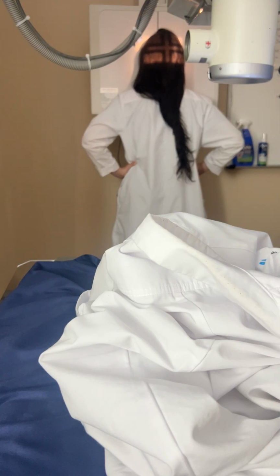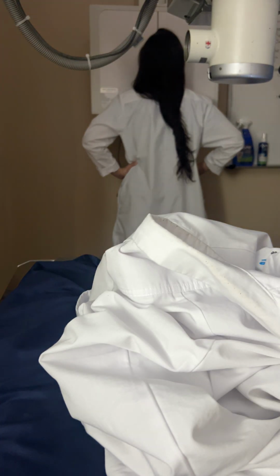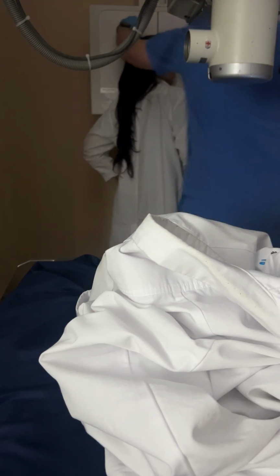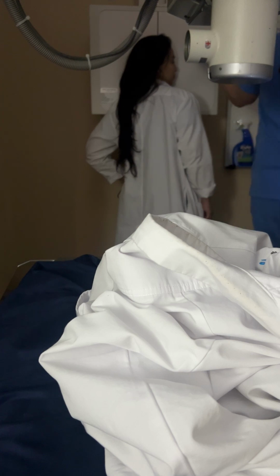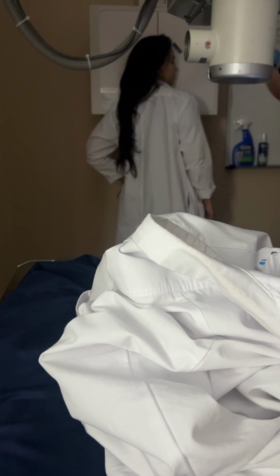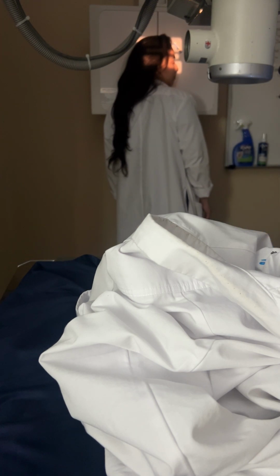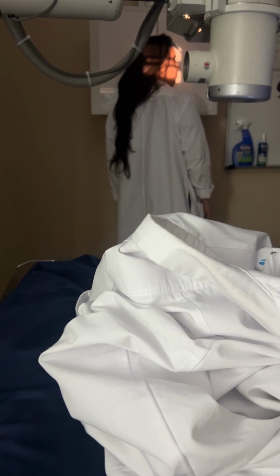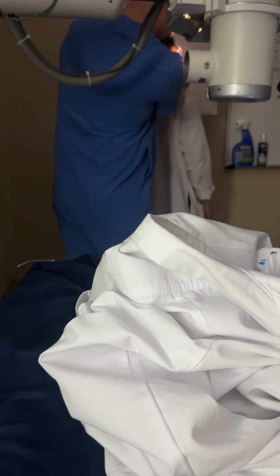All right. The CR and Waters method for sinuses, we already saw. It's the same as the one we did for the facial bones, okay? For the lateral for the sinuses, what is your CR centering for this one? It's a little different than the cranium and the facial bones. Half inch. Midway between the outer canthus and external... I don't know. So temple. Half inch to 1 inch posterior to the outer canthus. So we're going to come here. We're going to move her back.